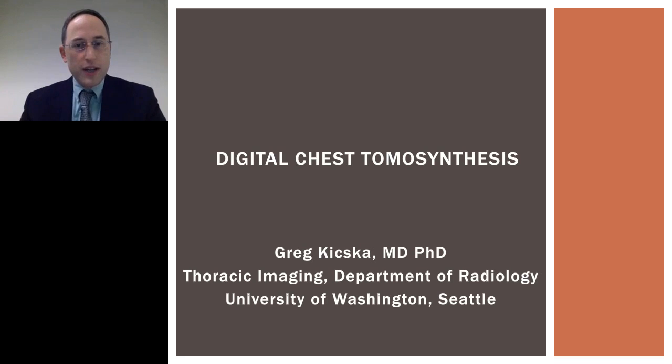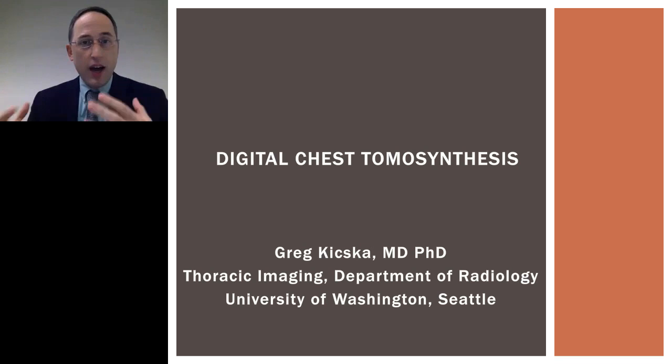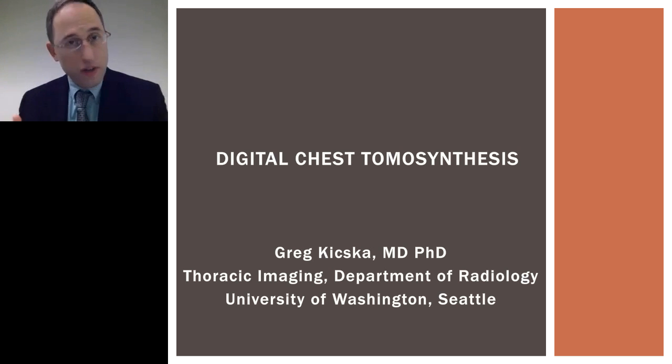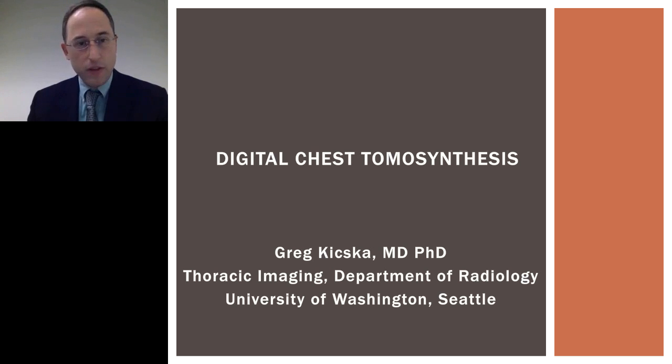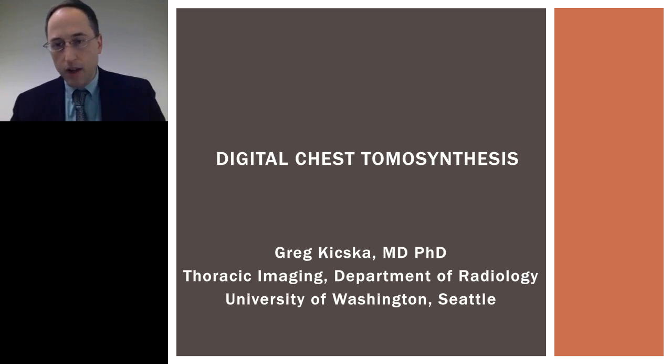We're going to talk about digital chest tomosynthesis. And I just want to say that I'm very excited to talk about this topic. Chest tomosynthesis is something that we do clinically, something I do research on. It's a modality that I'm very excited about, and I'm very happy to have the opportunity to help other people learn a little bit about it, become more comfortable with it, and maybe find a way to use it and help it fit in a way that really helps patients and helps us with our mission of taking care of people.